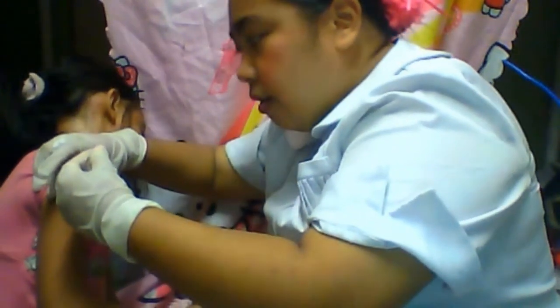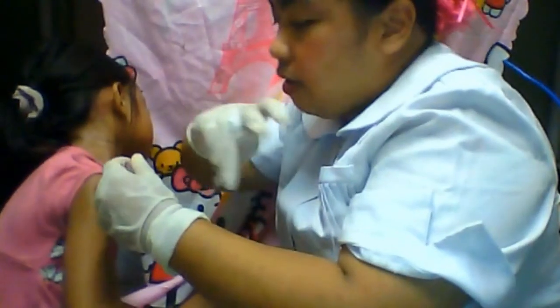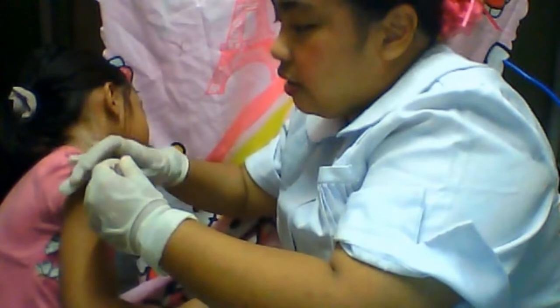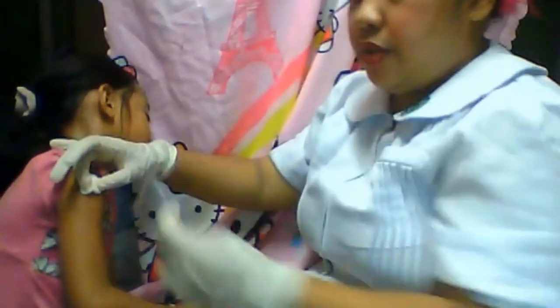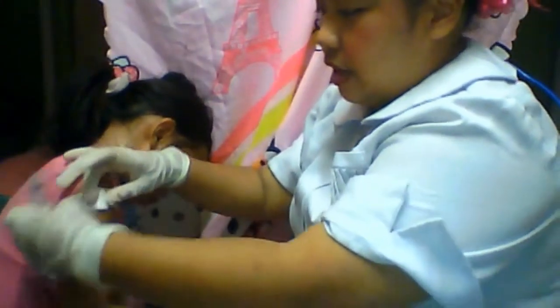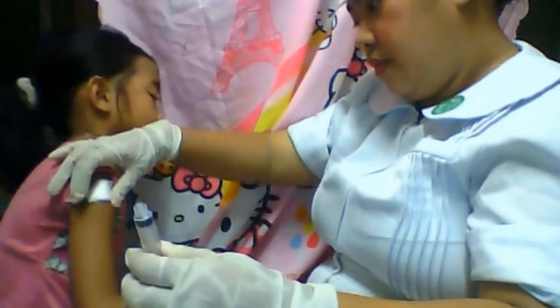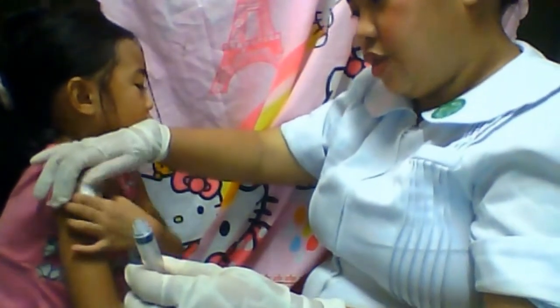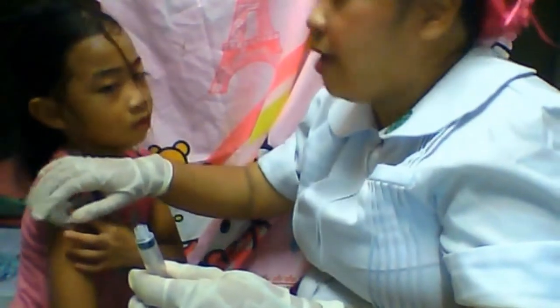Alright, once done, okay, you get your cotton balls, okay, and then remove, put the pressure, okay, do that. Mom, can you hold this one? Your patient should put pressure, but instruct them not to massage the area. Mom, do not massage.